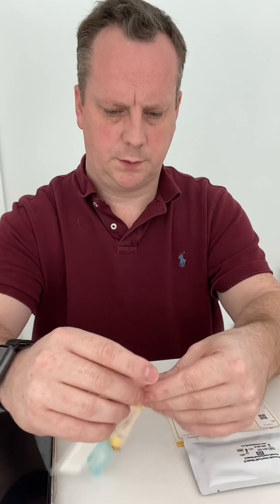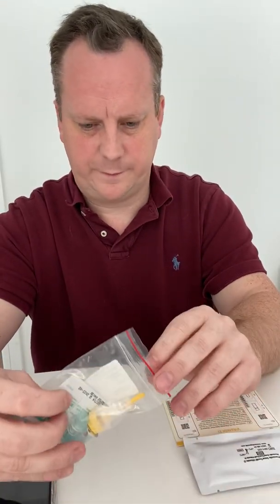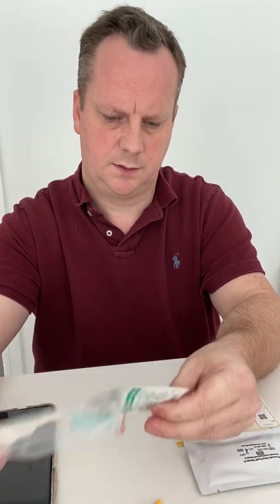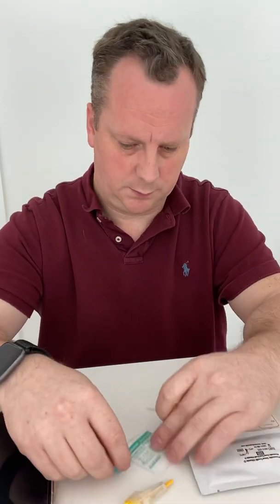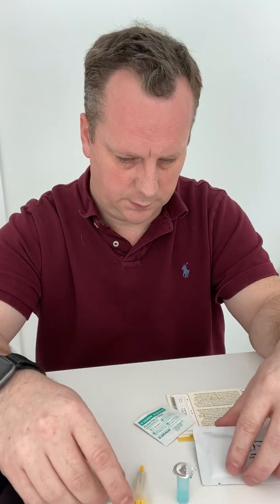Quick user guide — download the app, got that. It's always fine laying all the components out first to make it nice and easy. So we've got the reagent solution there, and the safety lancet — single use.